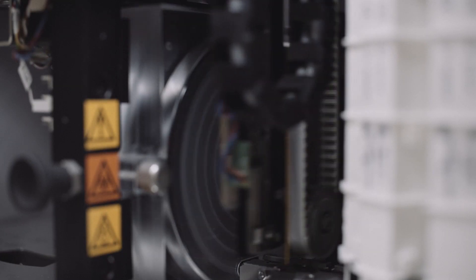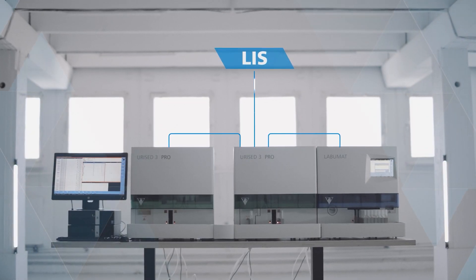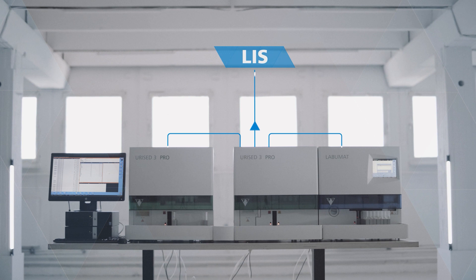The UriSed Cascade provides optimized sample distribution between the three instruments and offers barcode-based assignment of sediment and chemical results to each sample.